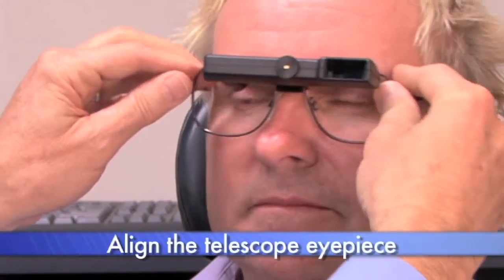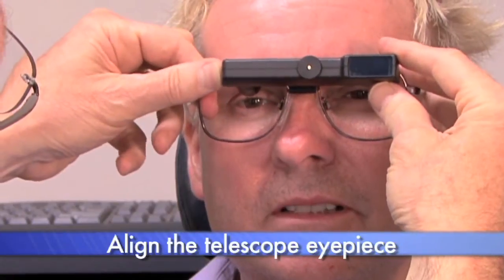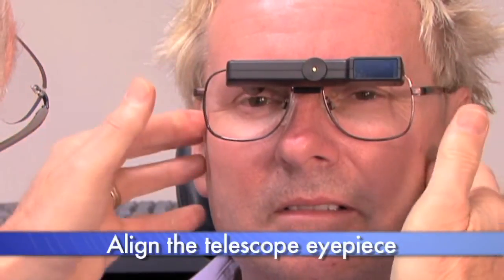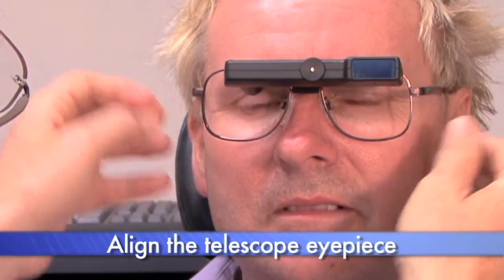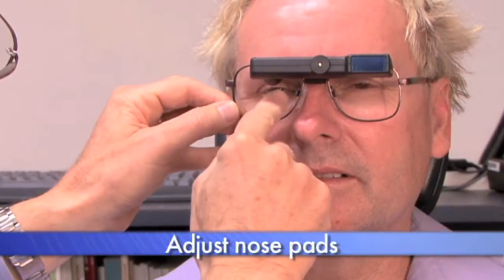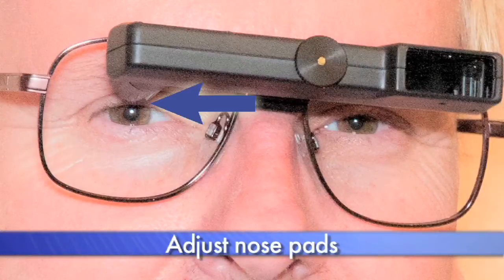Step one, once you're placing it on the patient, apply the telescope right to left to line the eyepiece up right above the eye that's going to be using the telescope. Step two, adjust the nose pad so the bottom of the eyepiece lines up at the top of the pupil.